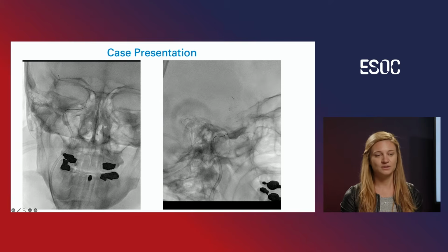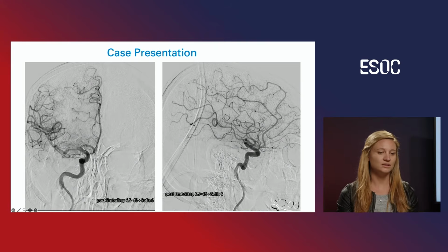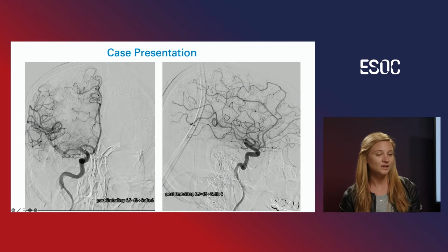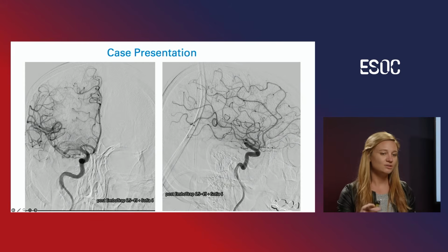So we did the maneuver with a combination technique: aspiration, stent retriever, and also the proximal flow arrest at this point, at the skull base. It worked very well. But if you have to do second or third maneuvers, then you have brought the balloon guiding catheter to the right place with this maneuver, but you have to take care of that.